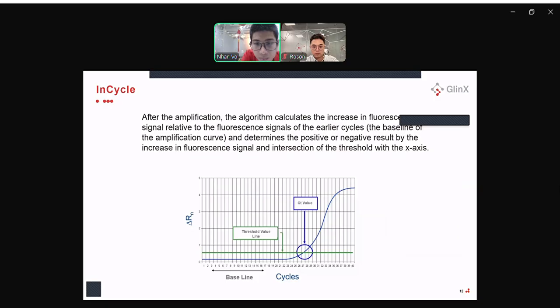But there is a little difference with the FCoV, the coronavirus, and the feline infectious peritonitis panel. Do you remember that? The CT value, I still remember there might be some difference. For the FCoV and FIP panel, the CT value is less than or equal to 39.